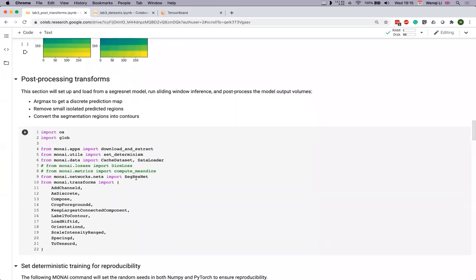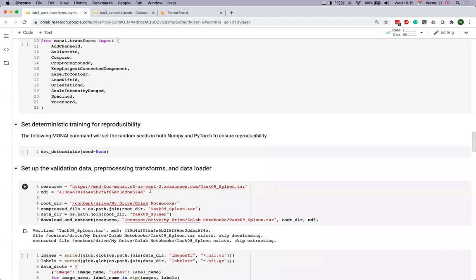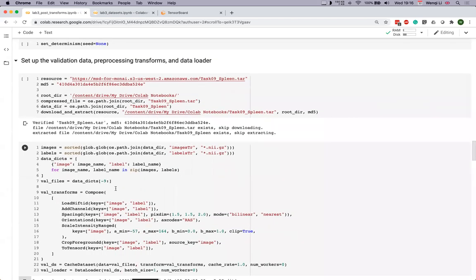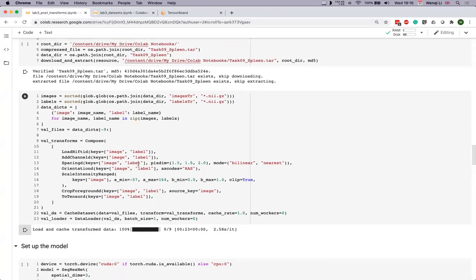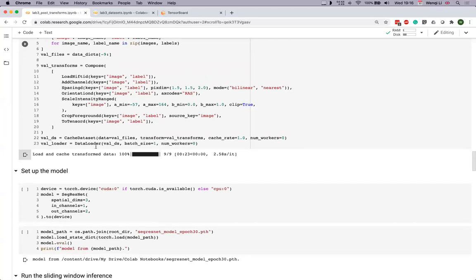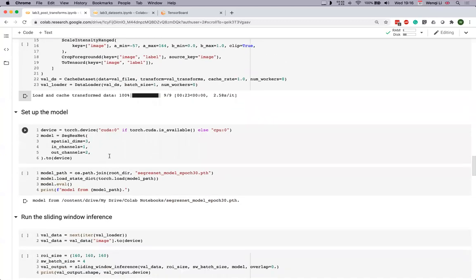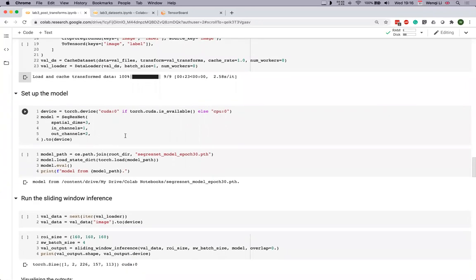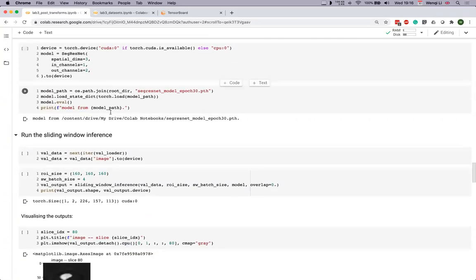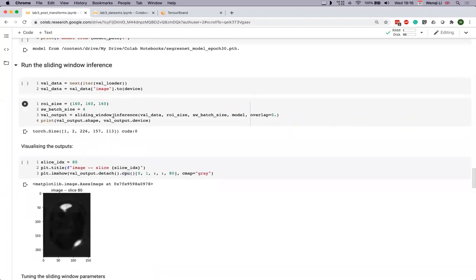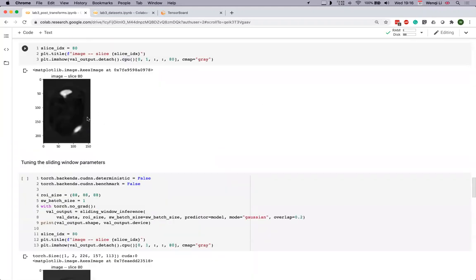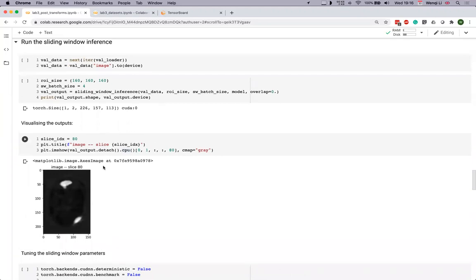The next section is a more realistic example based on a gently trained model for spleen segmentation from CT. It sets up the transformation pipeline, dataset, and data loader as usual, loads pre-trained weights, and uses them for inference — standard PyTorch approach. This demonstrates how different window sizes in sliding window inference affect the final output.